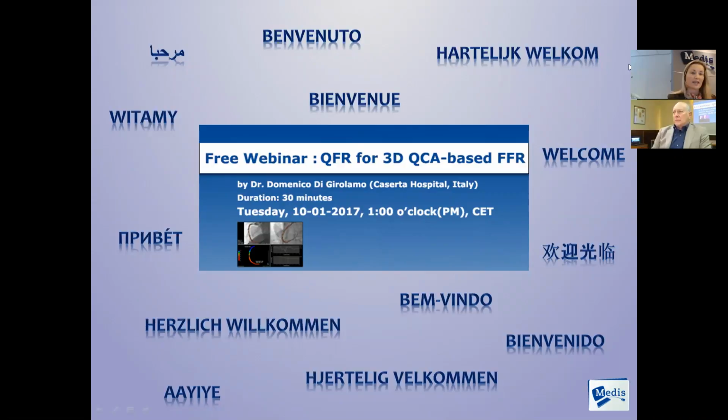Today, the interventional cardiologist, Dr. Domenico Di Girolamo from Sant'Anna e San Sebastiano Hospital, Italy, will present our new solution, the QFR for 3D QCA-based FFR, and will also give a live demonstration of the software later. So now, Mr. Gerhard Koning, our product manager from Medis, will start and give you first some technical background information, and then Dr. Girolamo will take over.